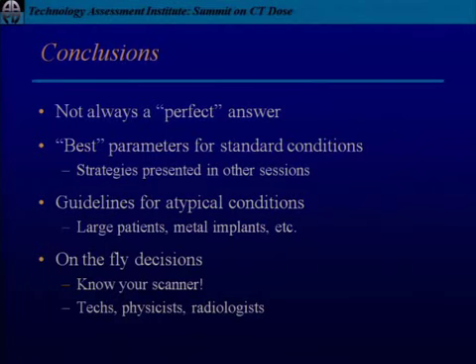You're really looking at, what detectors am I using in this 40 millimeter width? And so you can have a 0.625 slice or a 1.25 slice or whatever slice you want, and there's no dose consequence in a helical scan. Is that true or not?